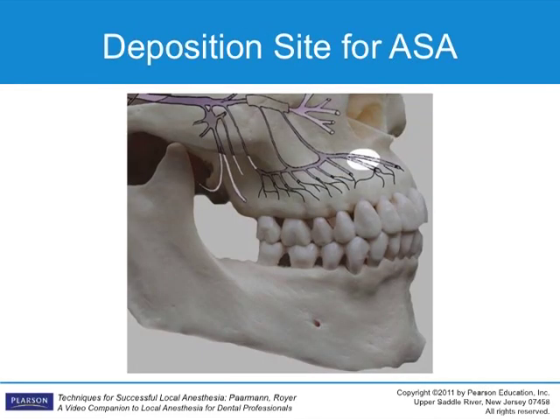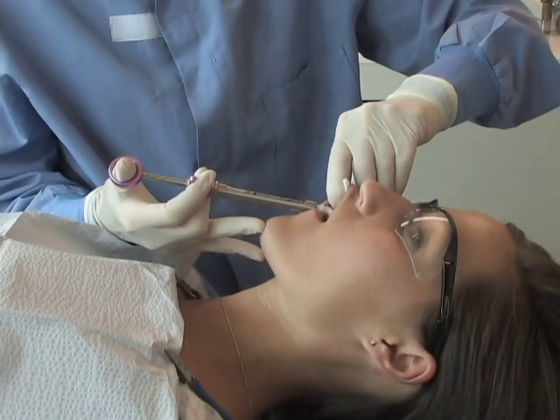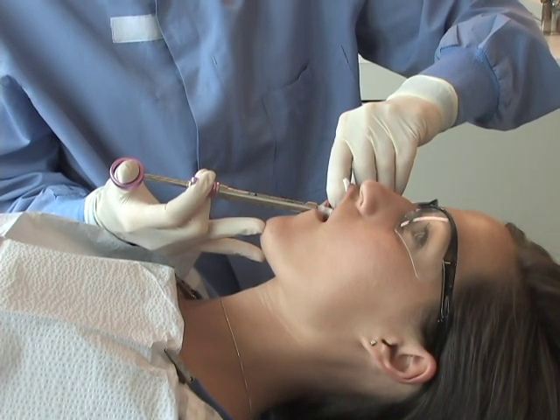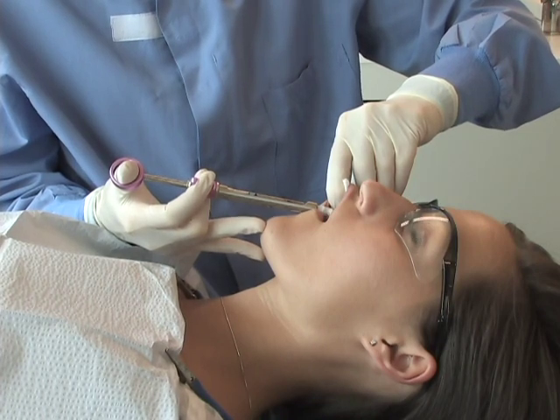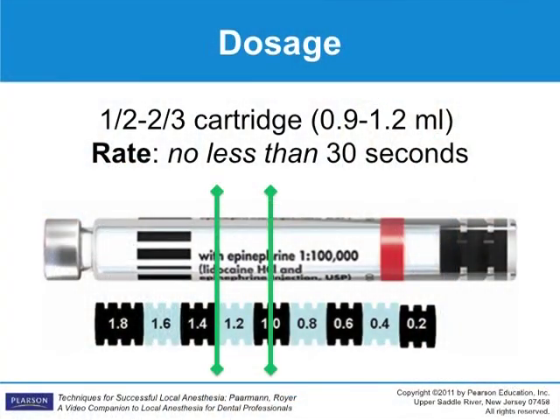Aspirate at the deposition site. It is slightly more difficult to aspirate in this area than other areas of the mouth. Be careful not to remove the syringe from the tissue while applying negative pressure to the thumb ring. A minimum of one half of a cartridge over a period of not less than 30 to 45 seconds should be deposited. The volume will vary depending on patient factors and planned procedures.